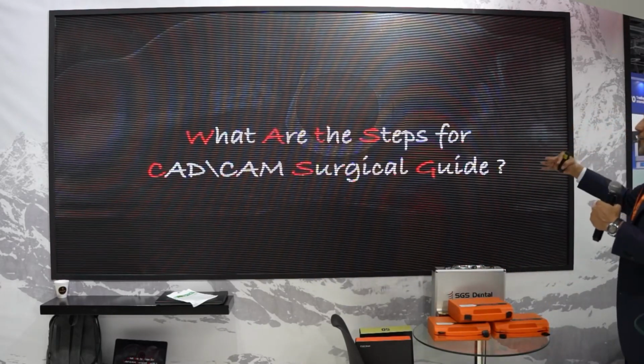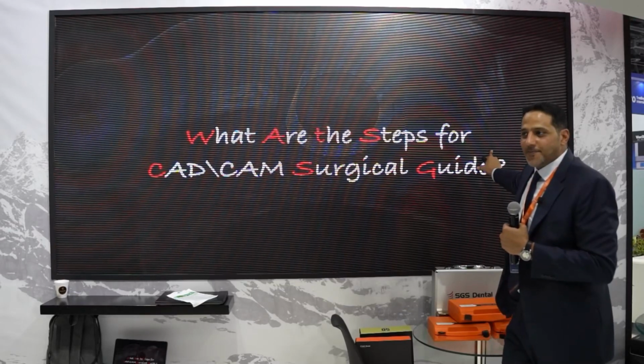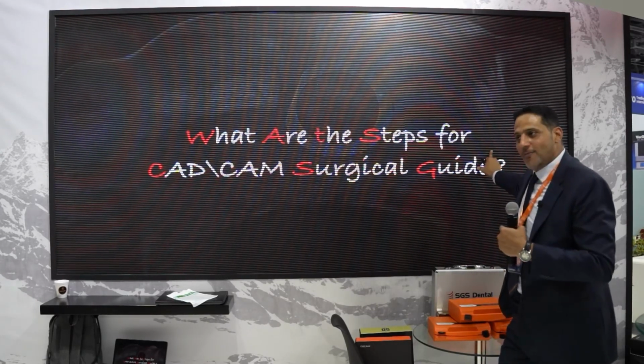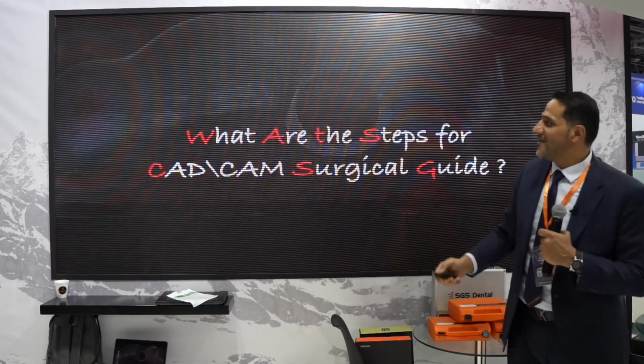What are the steps for the CAD/CAM surgical guide? To get the STL file, then DICOM, exactly.